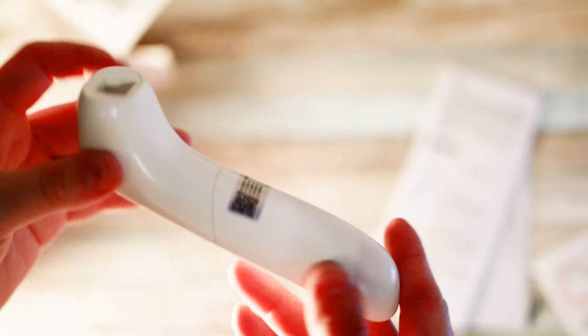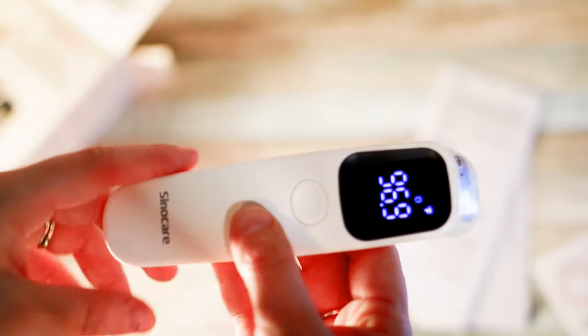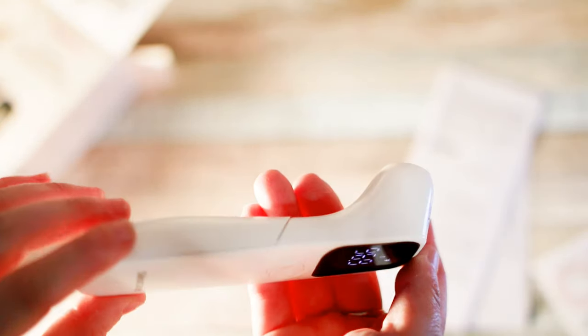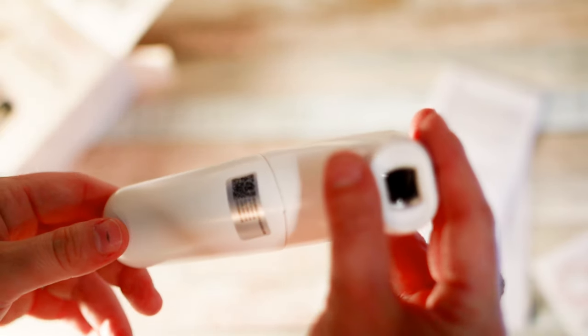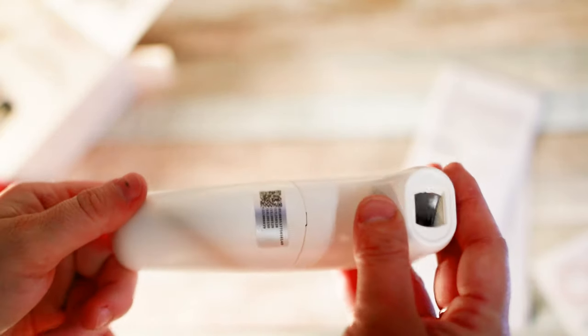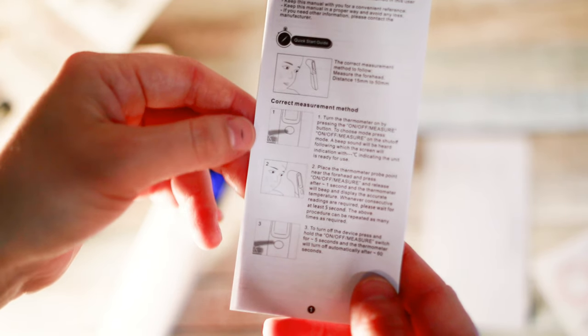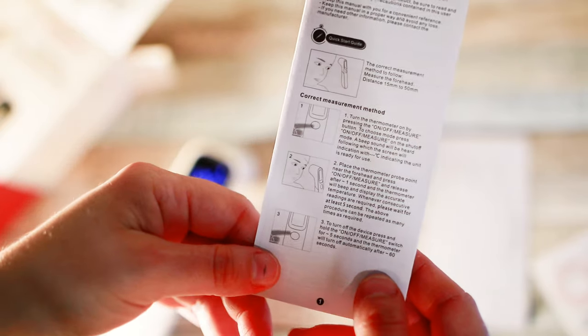So just as far as a quick unboxing and doing a quick little demo to try it out — I really like it. I like the fast reading. I like how it's lightweight. You can see it's compact in size, so very easy to store away between uses. It came with batteries, which is a huge plus because a lot of things don't come with batteries these days. And then, should you need it, we have the instruction booklet which will explain how to use it, the correct method of measurement, and all that.